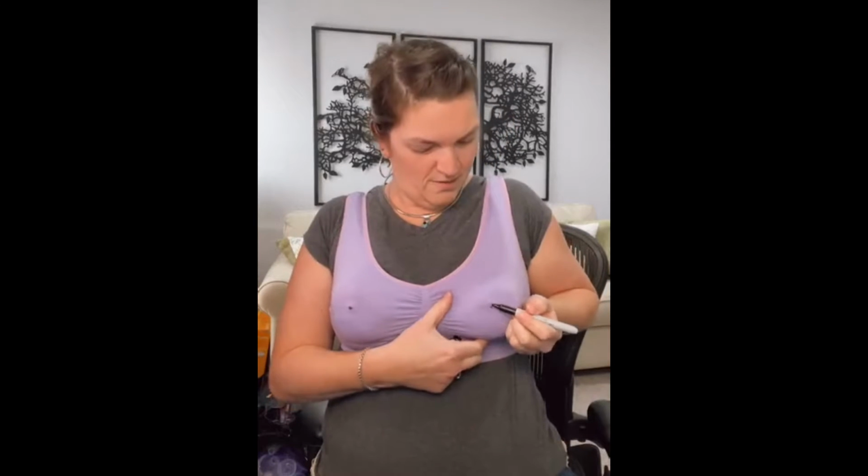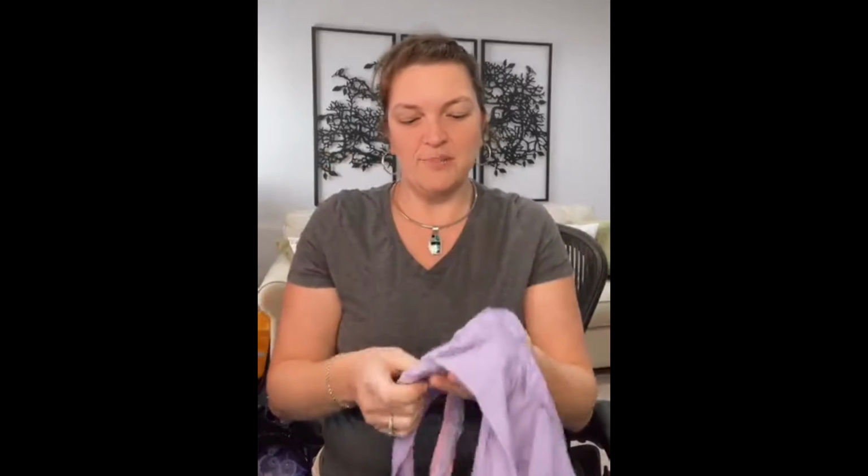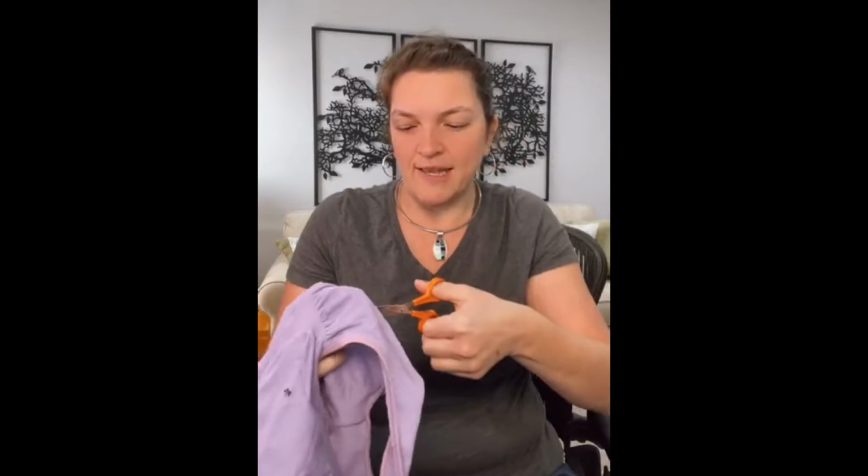So what you're gonna do first, put that sports bra on, find where your natural nipple is, and you're gonna mark a line of, hey, here's where my natural nipple is. Okay, very important next step, take the bra off. Do not attempt to do this on your body. Now again, you might have to wrangle yourself out of that sports bra. Okay, but what you're gonna do is mark where your natural nipple is, take the sports bra off, and then take your scissors and you're going to make a little slit, okay?